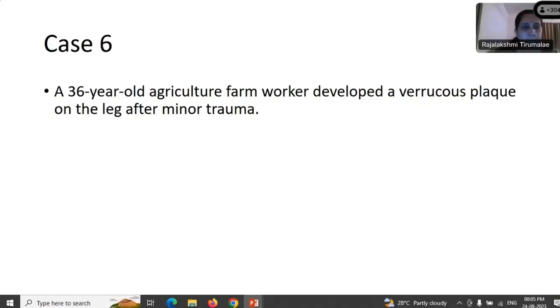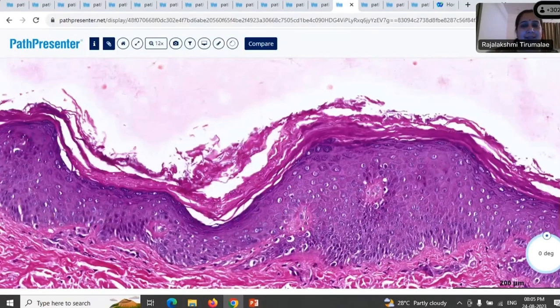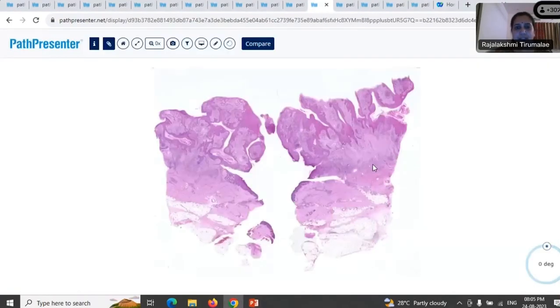Okay. Yeah, so this is a 36-year-old farm worker who developed a verrucous plaque on the leg after minor trauma. I think the history itself is a dead giveaway. One second, let me just open the slide. Yeah, right. You can start, Dr. Tina.